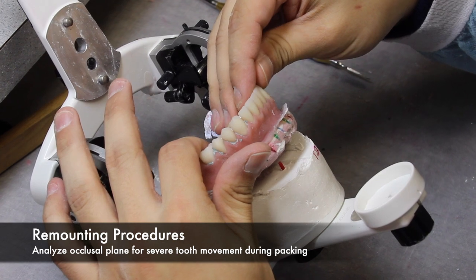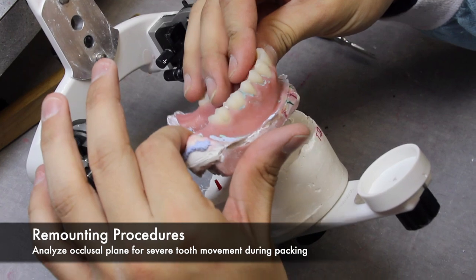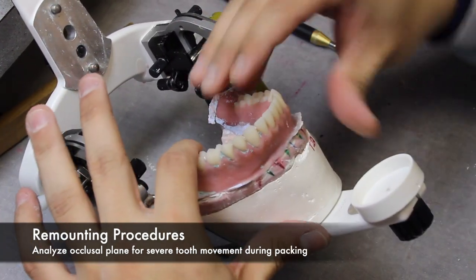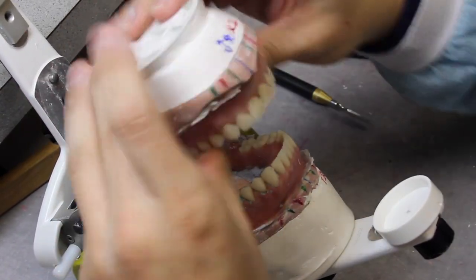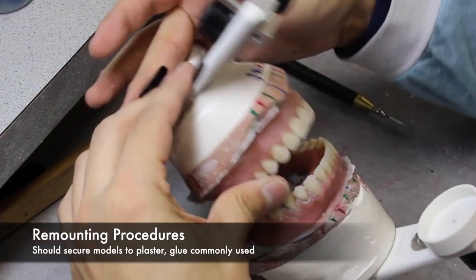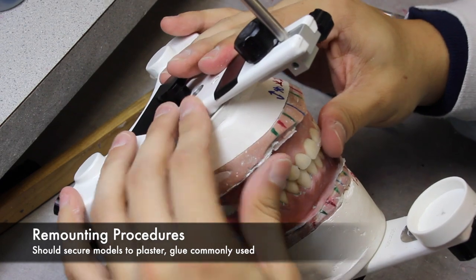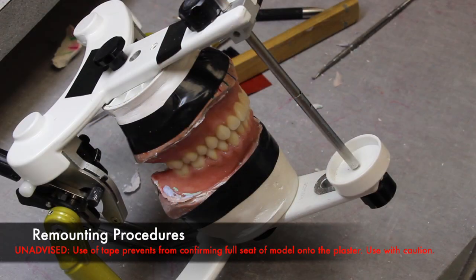At this point, the procedure of deflasking should already be complete and your denture should still be attached to your models. The first step is to analyze the occlusal plane for any severe tooth movement and adjust accordingly. The next step is to secure these models to the plaster mounts. This is commonly done with glue. The Air Force recommends using compound. In this video, you'll see the use of tape. It is unadvised to use tape because it prevents confirming that there's a full seat of the model onto the plaster, so use with caution.